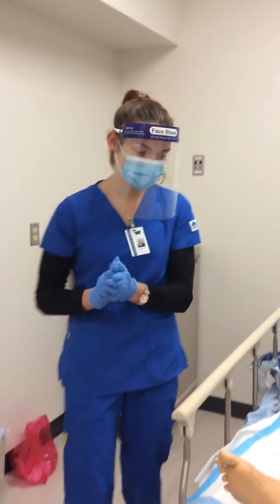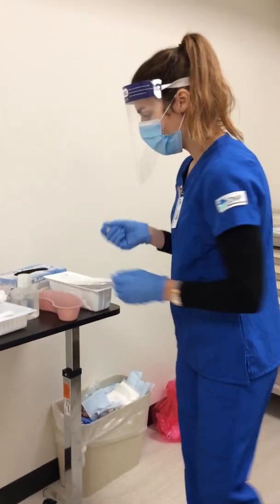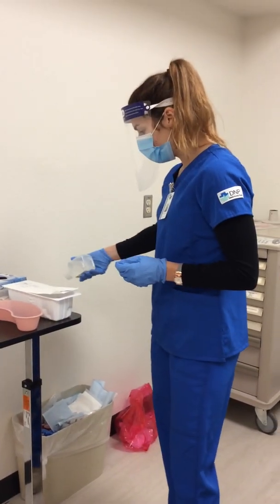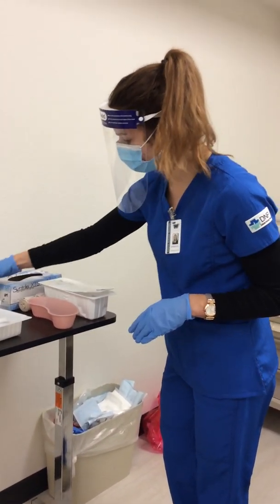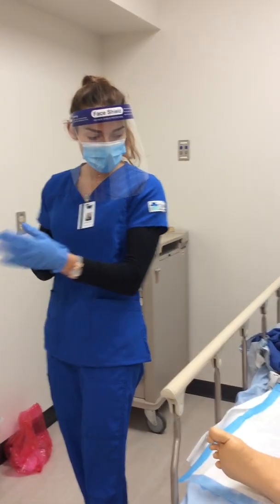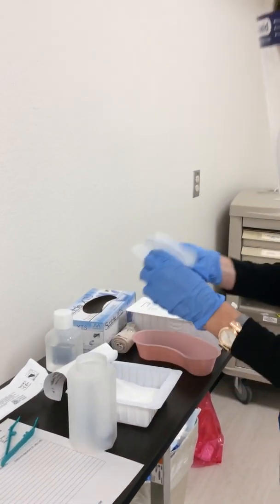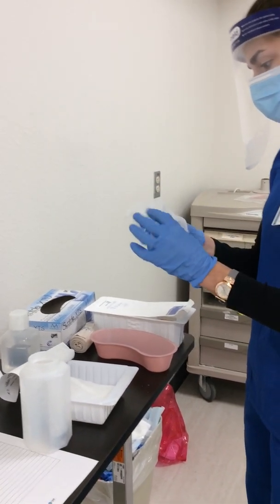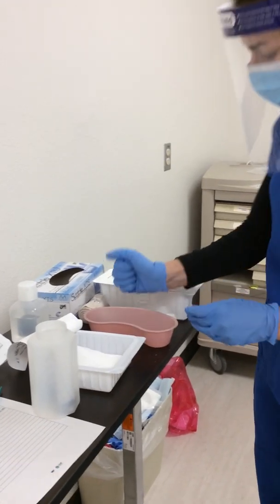We're going to get a new one of these. And then I'm going to prep my saline again. So we're going to lip it. I don't have gloves on right now. Pour that into the basin. And then I'm going to put on new gloves, grab a gauze, and we're going to fluff it. And then we will saturate it, squeeze out any excess.